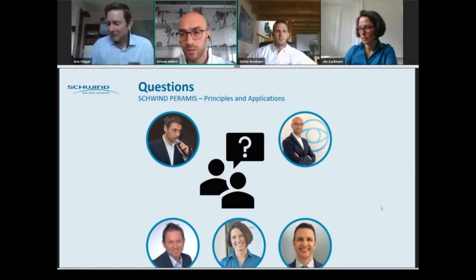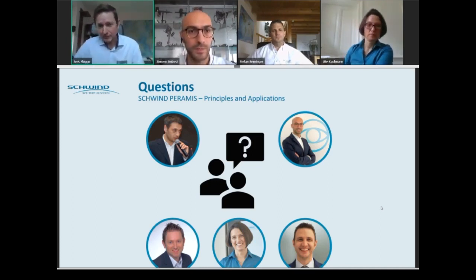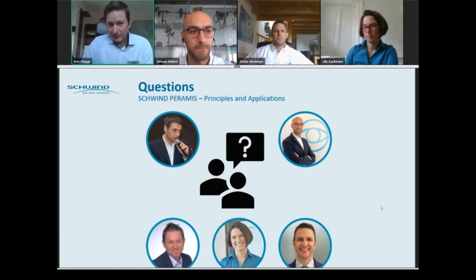All right, perfect. And regarding dry eyes, what about artificial tears? What would be your recommendation prior to a measurement? Because I personally always, when I go out from the application part, I tend to not to use artificial tears if it's not necessary, of course, but sometimes if you have really dry eyes, it might be necessary. So what is your opinion?